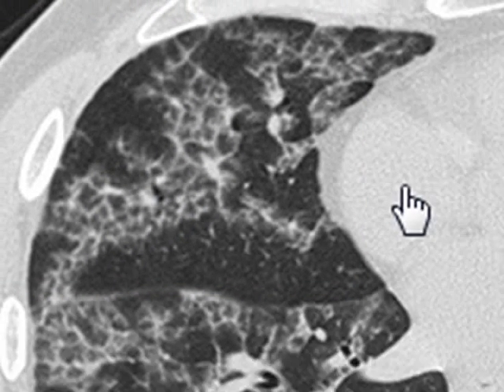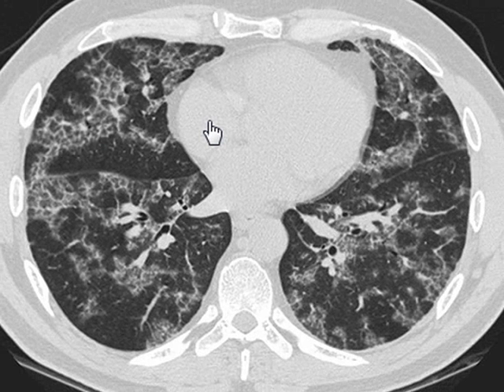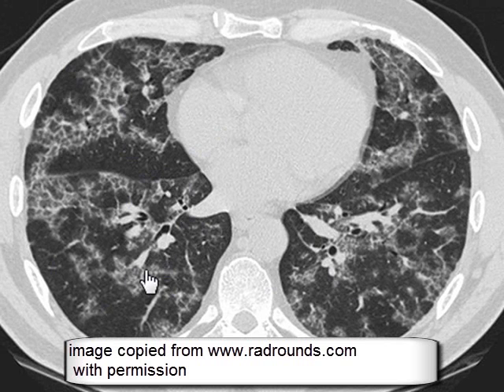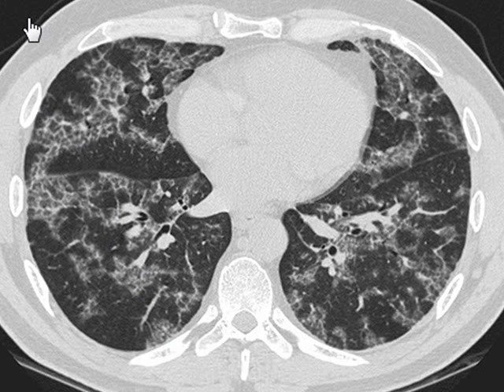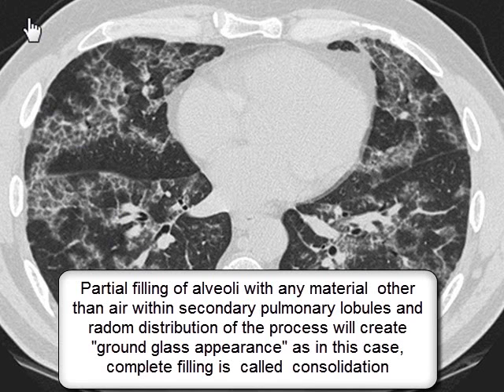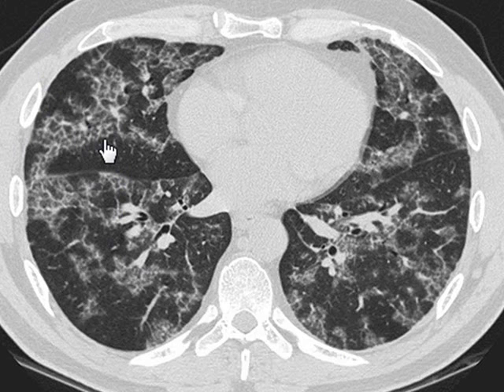This image is a good example of both septal thickening, which indicates interstitial abnormality, and ground glass opacity distributed randomly throughout both lungs. Ground glass opacity signifies an alveolar process, which has involved all or some of the secondary pulmonary lobules — some lobules are affected while others are not. This combination of findings is known as the crazy paving pattern, which resembles a pavement.